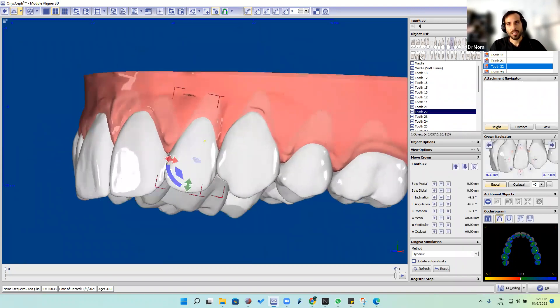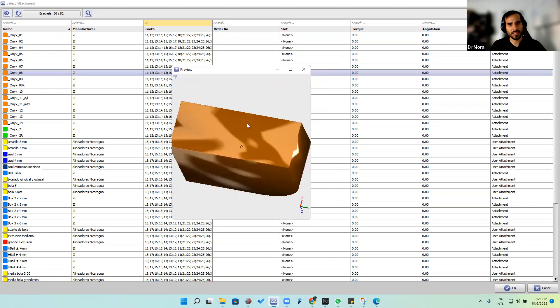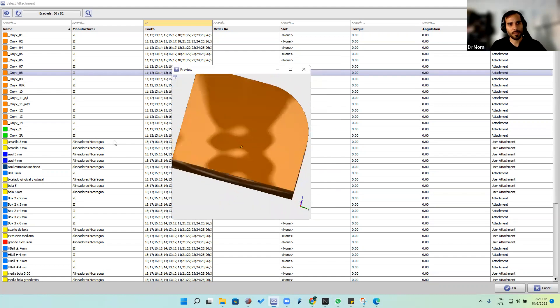When we try to place a sash attachment, we select the tooth — we go to tooth 22 here, select an attachment — and we have these attachments that you can see with this shape. We're going to select this attachment.